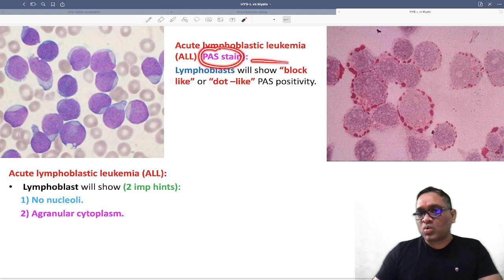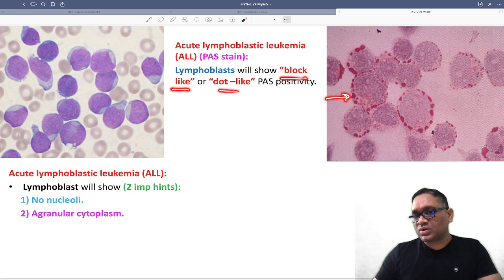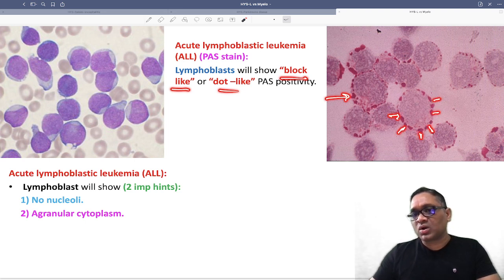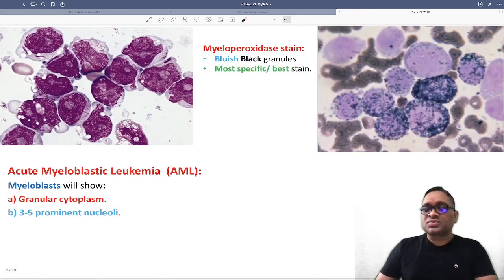Two important hints to remember: no nucleoli and agranular cytoplasm. When applying PAS stain, you can see block-like or dot-like positivity at regular intervals. These are all PAS-positive lymphoblastic cells.